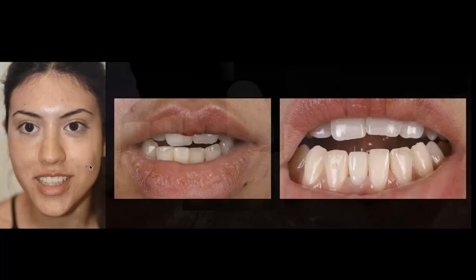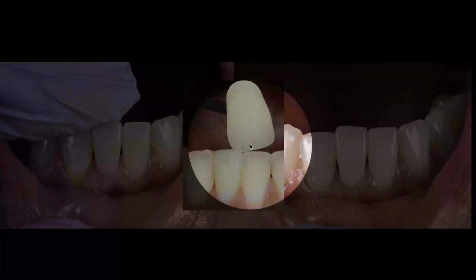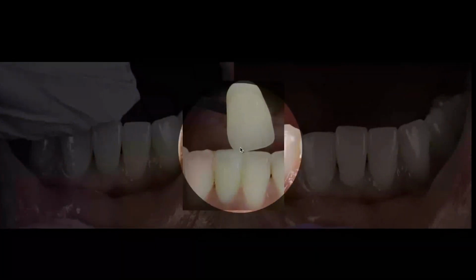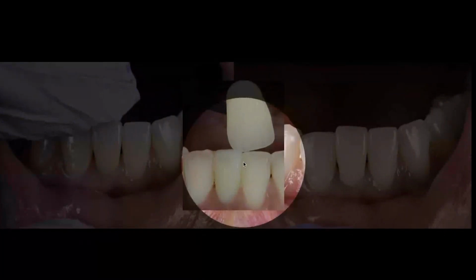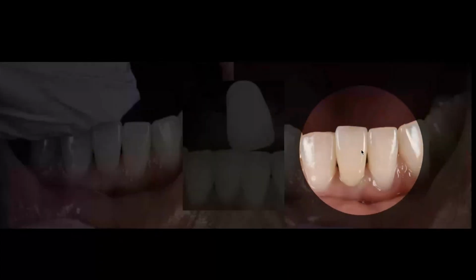The color is critical. You see my polarized photograph here, and the polarized photograph sends me pretty close. I mean, there were definitely some little tweaks here and there that I could make, but really what's going to make it blend is what we talked about before. Look at the light. Look at the light reflection.